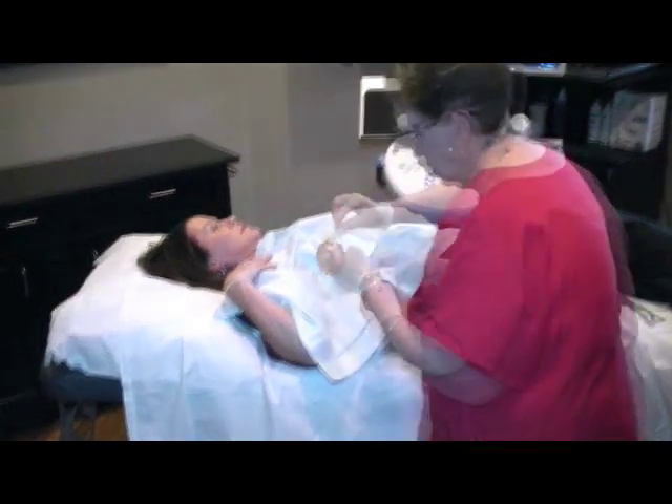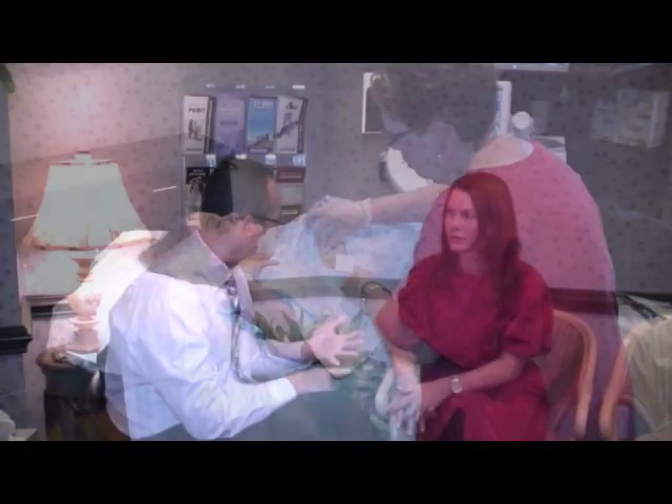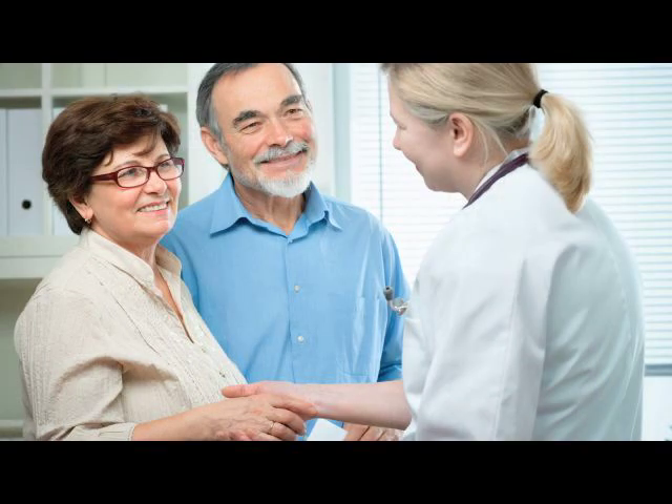Following the procedure, the skin surface will be cleansed and a sterile dressing applied to the region. Post-procedure instructions will be reviewed with you. The tissue obtained during the procedure will be submitted to the laboratory and results are usually forwarded to your doctor in three business days.